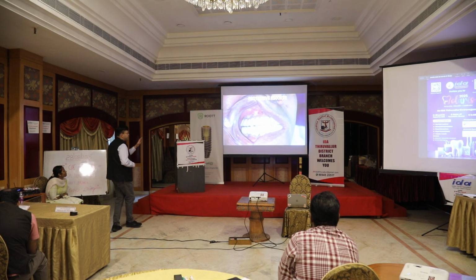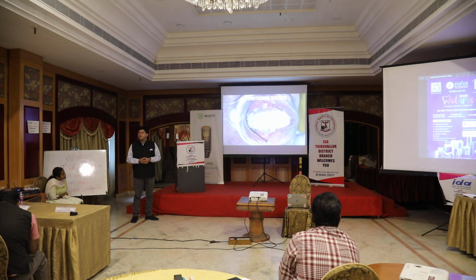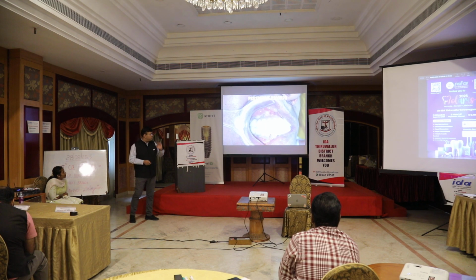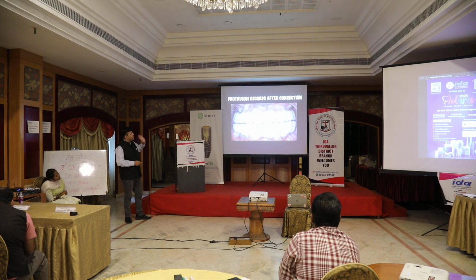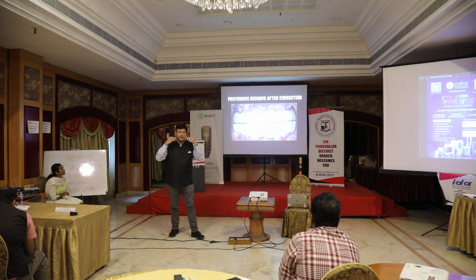When I am asking the patient to do a protrusive, can you also see a premolar coming in contact? Should it come in contact? In protrusive? No. So what we are going to do is we are going to reduce it. Now is it correct? Automatically I have not touched the anteriors. I have just balanced my centric. I have just balanced the protrusive.